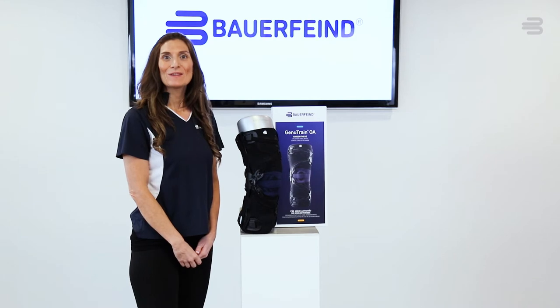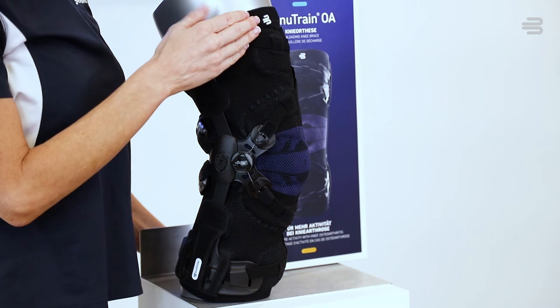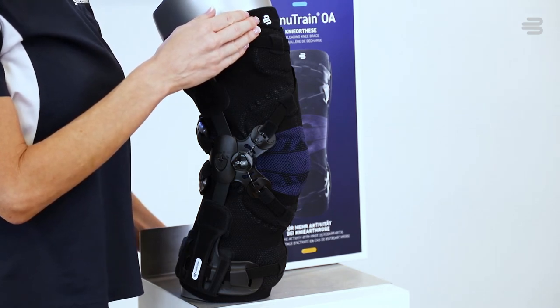When taking the brace out of the box, locate the white Bauer Fine logo. This will indicate the top of the brace. It is also where the brace should be centered on your thigh.